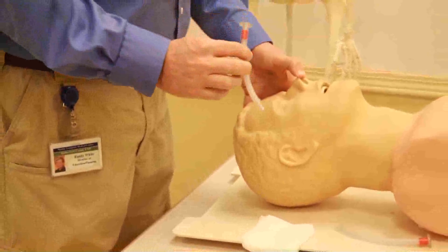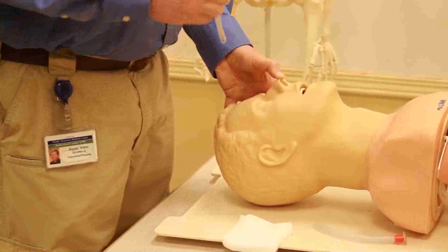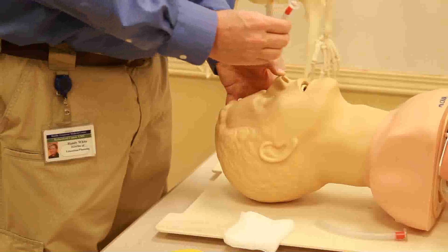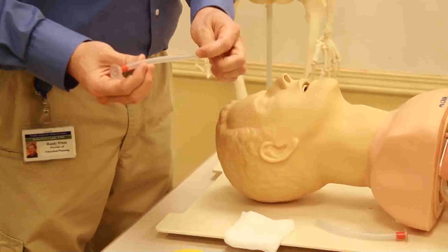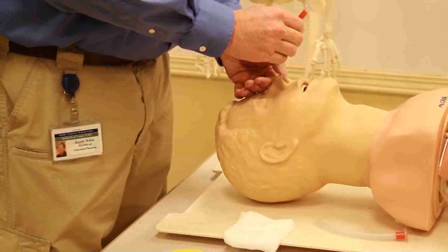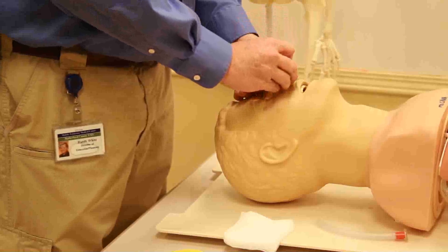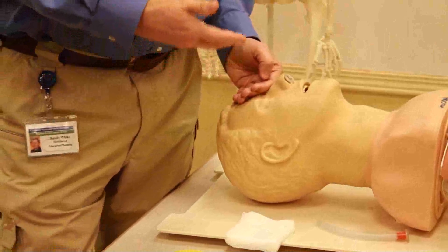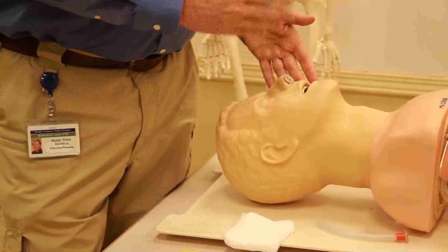We're going to take our lubricated airway and begin on the right side. In most people, the right side is usually the straightest and most open side, making it easier to insert the airway. We're going to take the bevel of the airway and put the bevel toward the septum, then push the airway straight down into the patient. From here, we can keep the airway open, keep the tongue off the back of the throat, ventilate, oxygenate, and do whatever we need to.